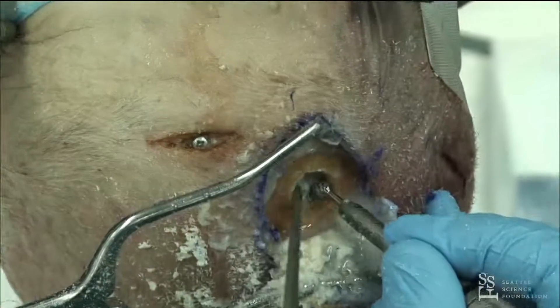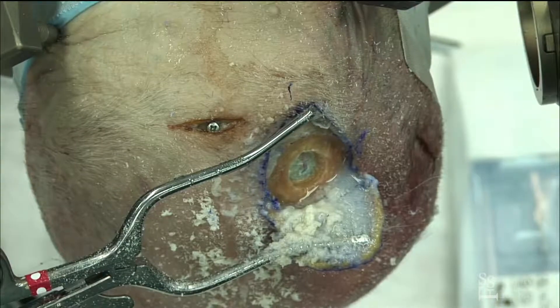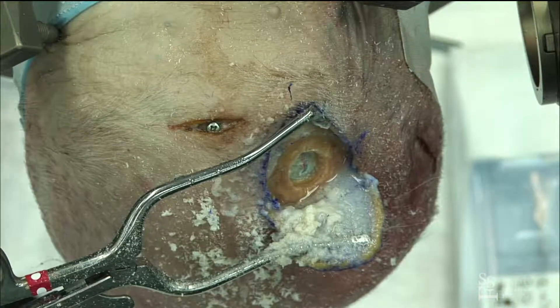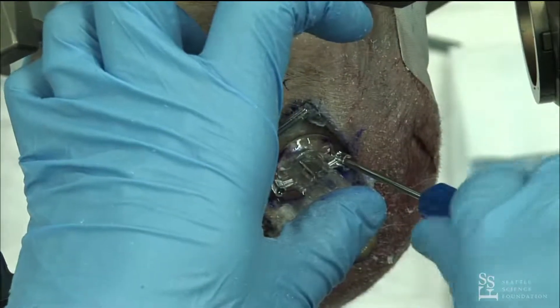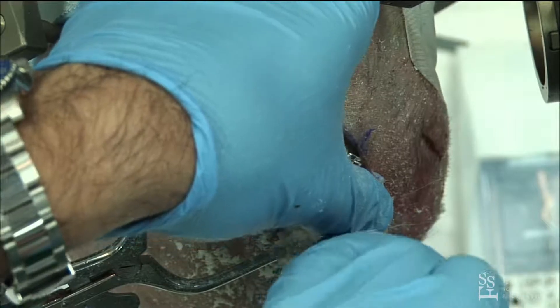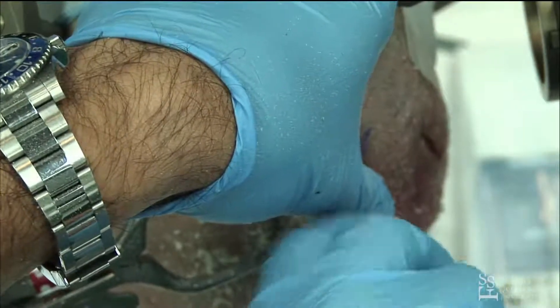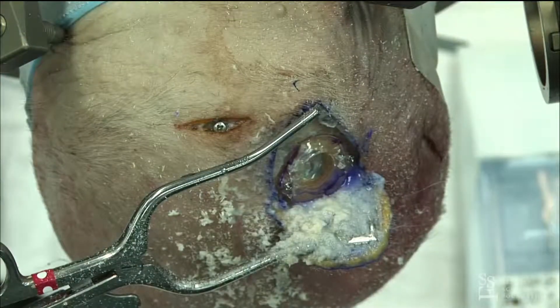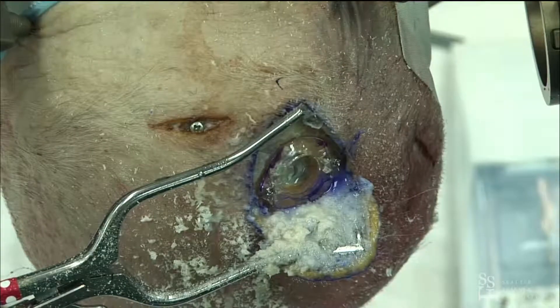I'll take out that little rim with the burr — the little rim they leave behind with the perforator to protect it. And with a curette, I'm just going to make sure that any remnants are gone. Now we're ready to place the Stimlock on. One thing is, it's good not to tighten the Stimlock all the way — I'll wait to do that for the end. The little clip that you put in has these fine little tines that need to slip underneath the Stimlock. So once we countersink, the Stimlock may be flush with the bone and there won't be that room. So now we're all ready for the lead.